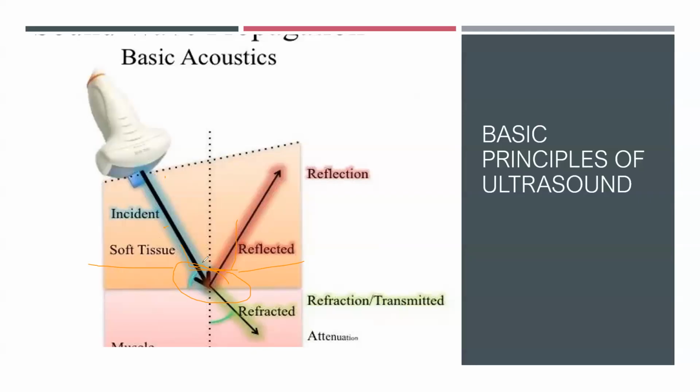So again, I'm going to show you how I hold the probe, and I'm not saying that that is the way to do it, but a simple example that I'd like to give you with a Sprite can. So have a look at my hand over here. This is the surface of the brain, and this is the probe. And really what I'm doing is I'm controlling the probe with my little finger over here. I am just incident, I'm in contact. And if I have a good gel interface with the fontanelle at this particular point, I'm going to get good quality images.